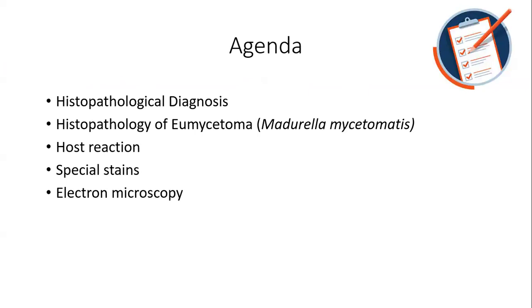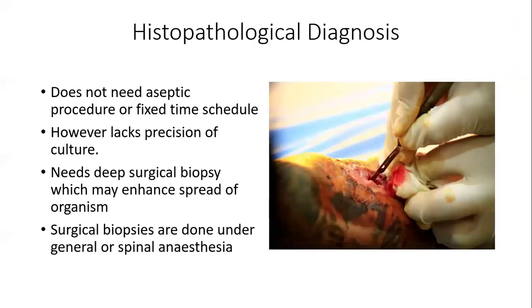Okay, sorry everyone. So this is what I will be talking about: the histopathological diagnosis, the histopathology, and like I said, I will mainly concentrate on Madurella mycetomatis, the host reaction, and a bit of special stains, and lastly, electron microscopy. So regarding the histopathological diagnosis, there are some advantages, of course.